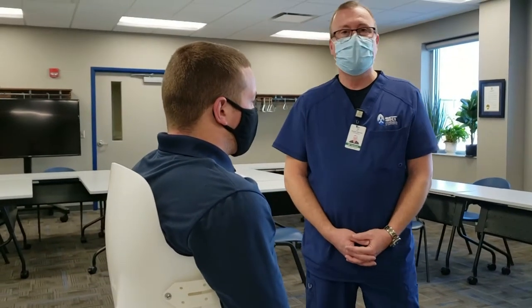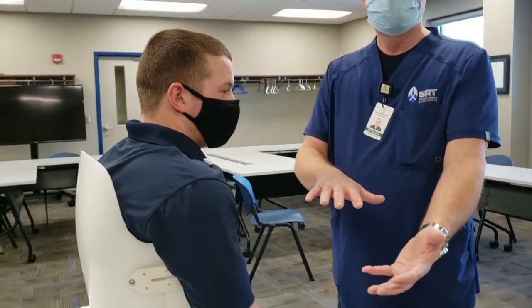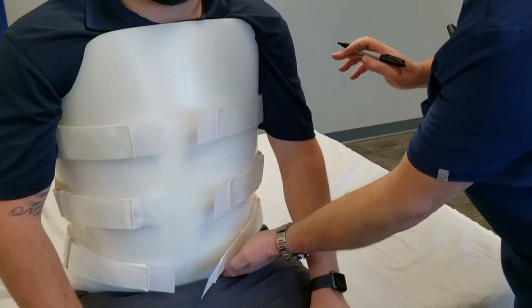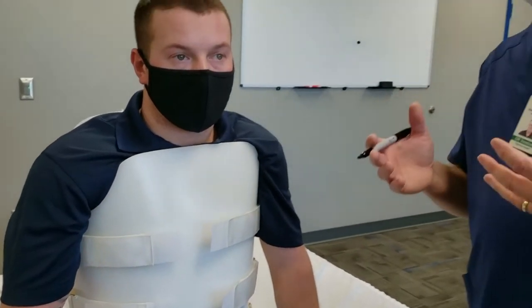That's the fitting of the custom TLSO. If the patient's injuries require, we would lay him back down to take the brace off. If we need to make adjustments, we would assess that and mark where these adjustments need to be made — maybe in the armpits or where it's pressing too tightly on his thighs — so that when we take it off, we can remember what adjustments are needed to give him the optimal fit.